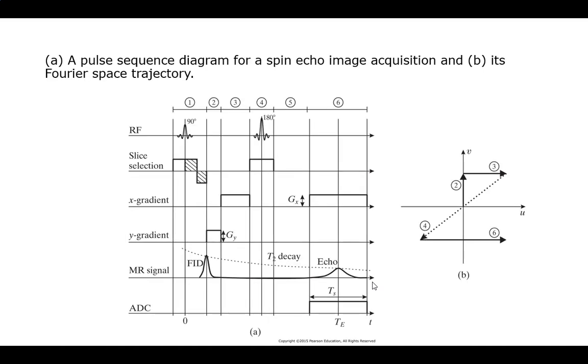Okay. Spin echo imaging. All the ones we've done here, we were directly measuring FID. It gets a little weird when we want to do echoes. Because remember how we had to do an echo? We had to do a 180-degree kick. When you do a 180 kick, what is a 180 kick going to do in frequency space?